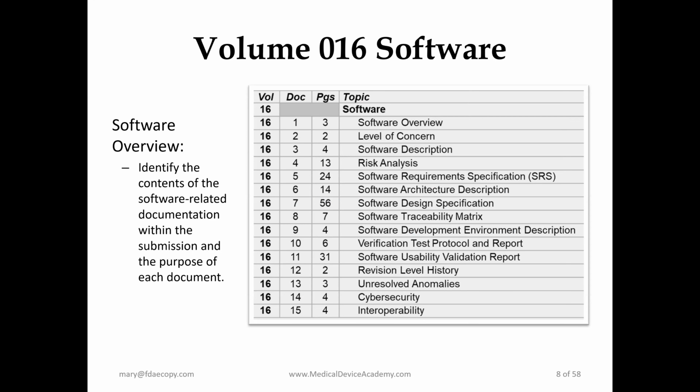And not all of these will always be applicable. Your device might not have interoperability as part of it, but this is the basis that we use to build our documentation for a 510K with regards to software. Next slide, please.